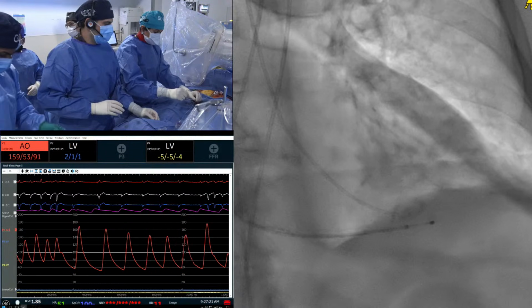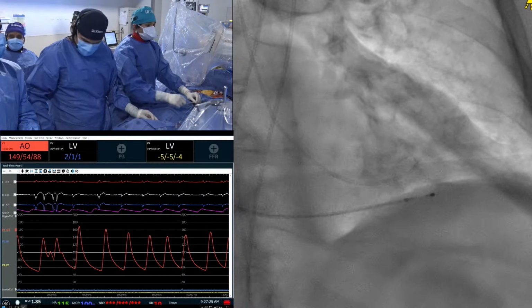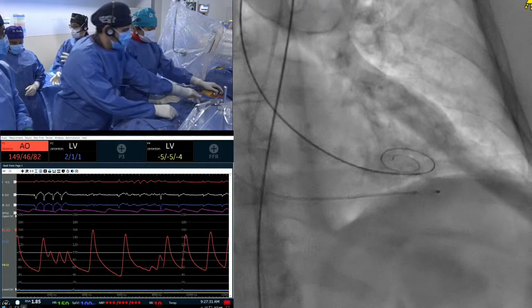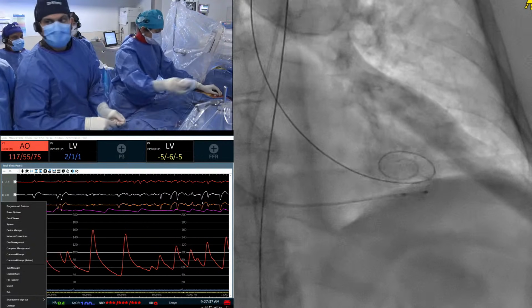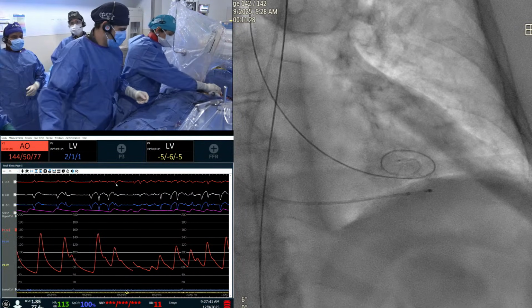Otherwise, you haven't done the patient any favor. And remember, when you implant a surgical valve, don't cant the valve because that can affect the hemodynamics. Some people try to jam a bigger valve in and tilt it. They used to do that for mechanical valves, and that's a big problem because some of the leaflets are not closing properly in diastole. So it's very important that you respect the native anatomy when you do these root enlargement procedures.